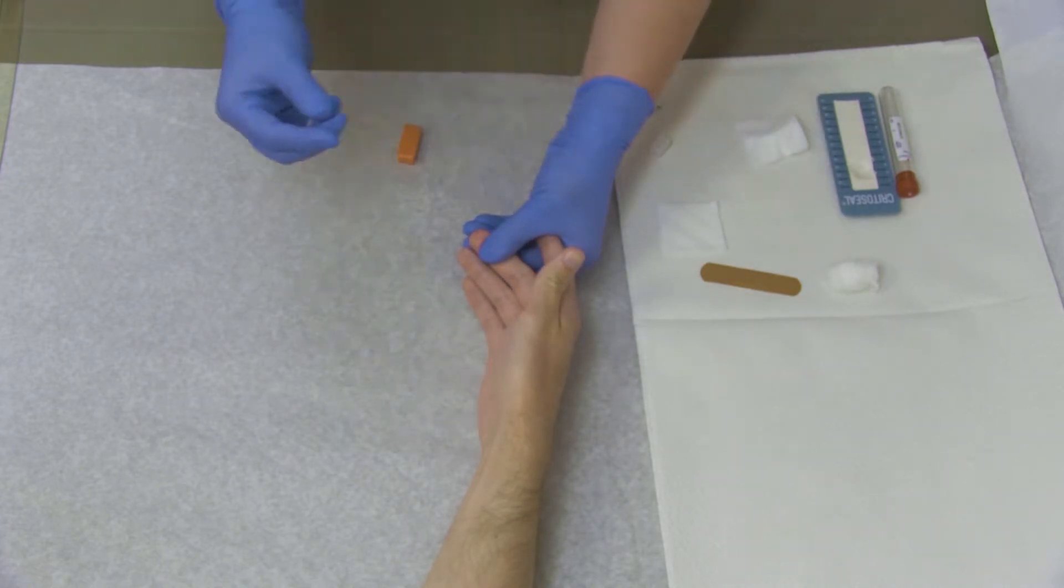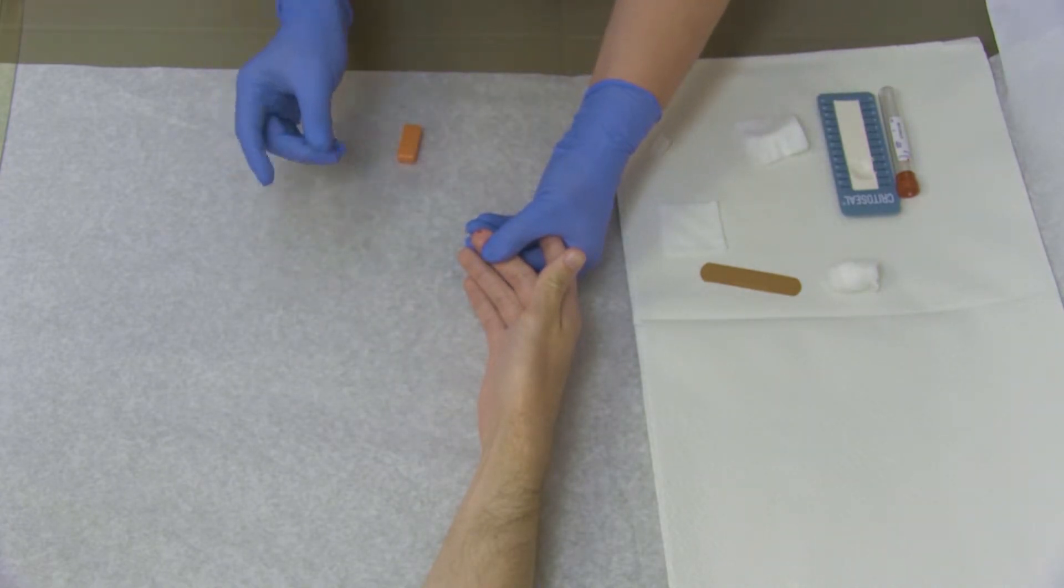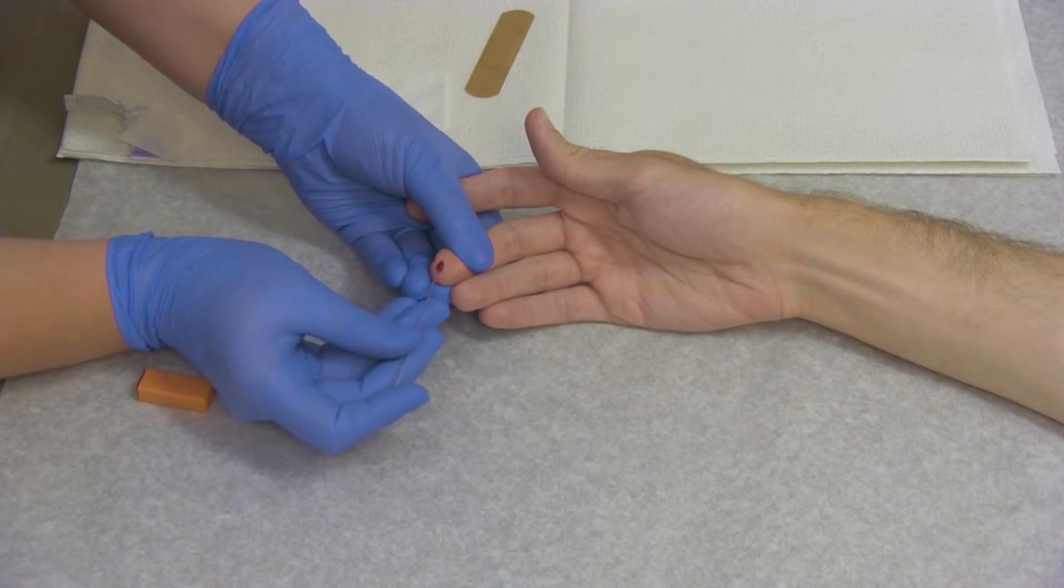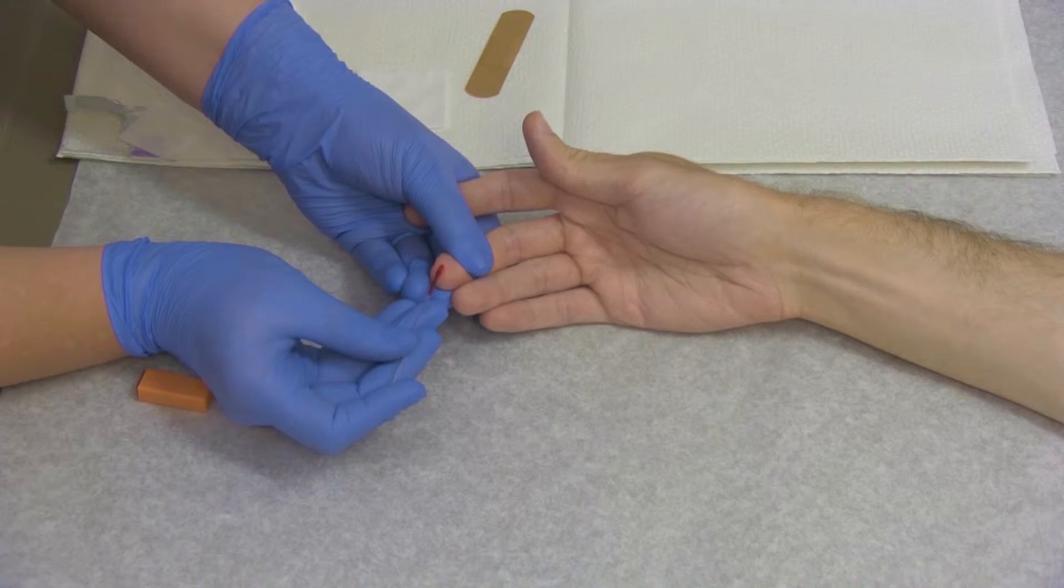Allow a well-rounded second drop of blood to form at the puncture site. Holding the capillary tube at a horizontal angle, gently touch the end of it to the drop of blood on the finger. The tube will fill by capillary action.